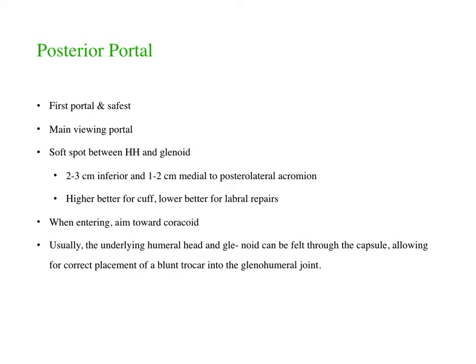The higher you place your portal, the more facility you will have in repairing a cuff, while a lower position portal appears to be better for labral repairs. When you're entering the joint, you should always aim towards the coracoid.